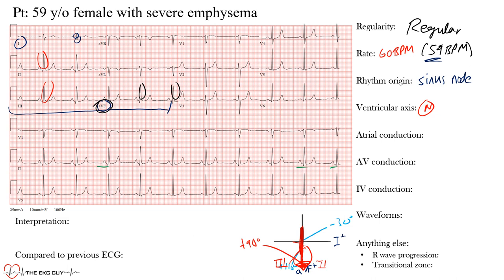The axis is at about +88 degrees. While technically within normal limits, in a 59-year-old female this should raise concern. Typically as we age, the axis shifts leftward as the left ventricle dominates. A rightward shift in an older patient — possibly from right ventricular strain or right ventricular hypertrophy — is something to be aware of. We'll discuss this more shortly.